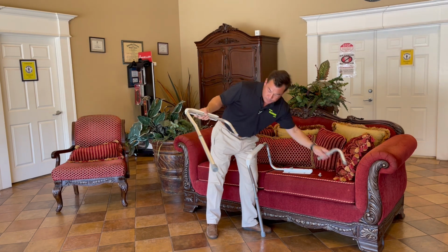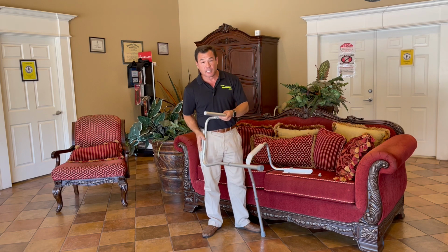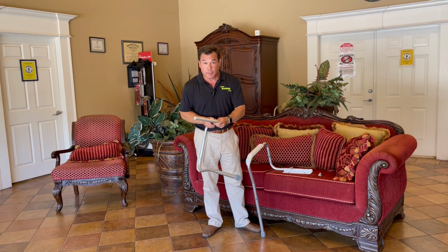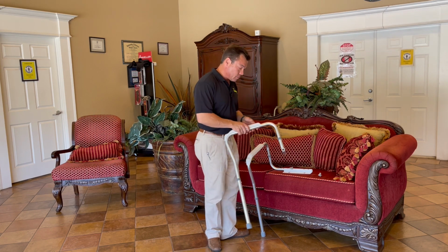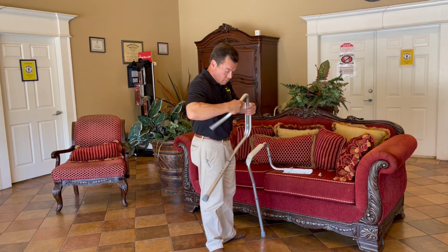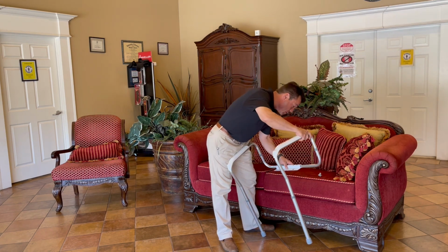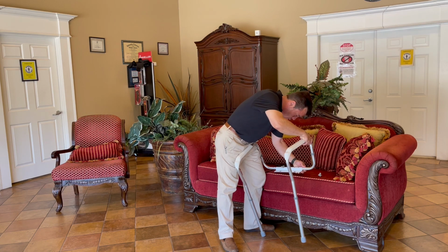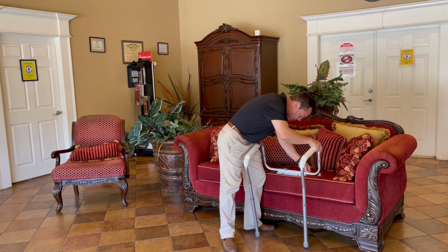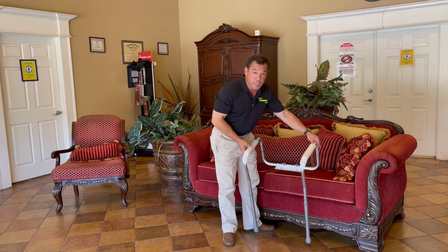Now we do quite a few of these for folks. As I said, some people have not gotten to the point where they cannot make it to the bathroom, but generally speaking, the only things covered within the bathroom are covered by Medicaid, and this is not one of the things that is covered. But people still like these things. So once this is firmly attached here, you've got your setup.